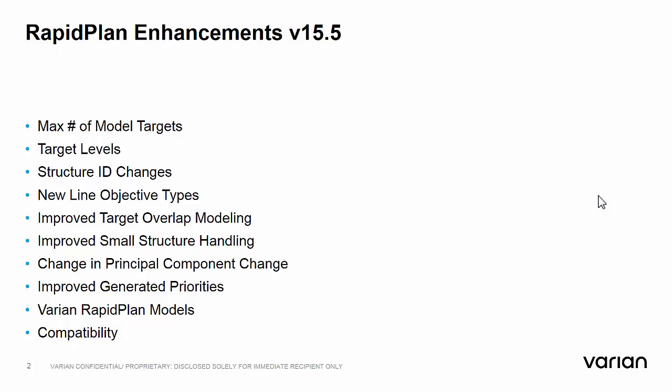Many changes have been implemented in RapidPlan version 15.5. Here is a list of these enhancements. In the next few minutes, we will explore each of these areas.